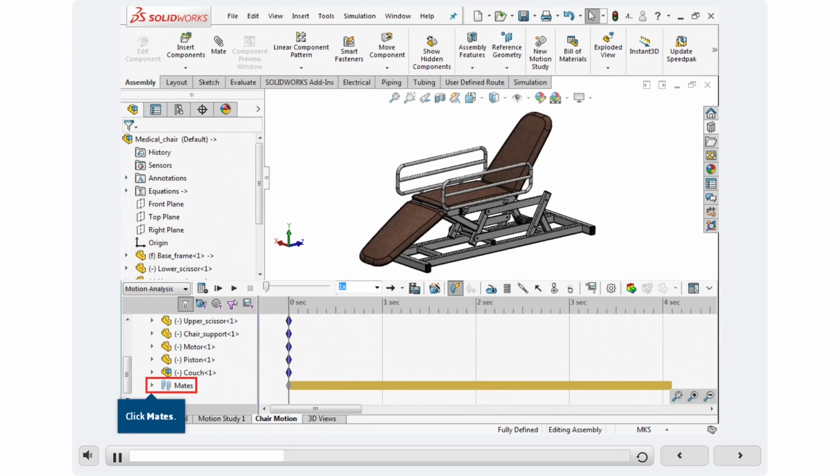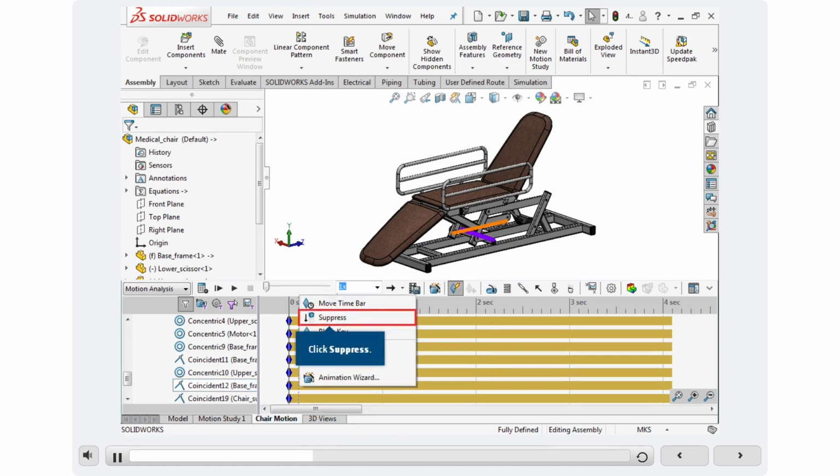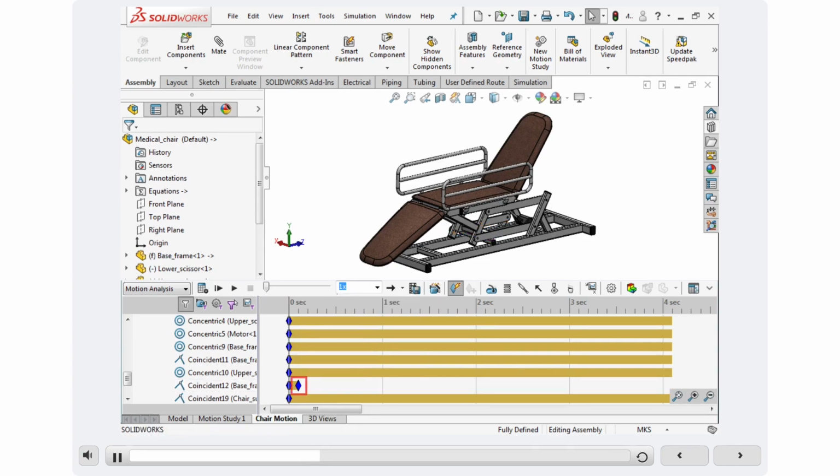Expand the Mates folder in the Motion Study tree. Click Co-Incident 12. Right-click in the timeline at 0.1 seconds and click Suppress. This creates a key that suppresses the mate at 0.1 seconds so that it will have no effect after this time.